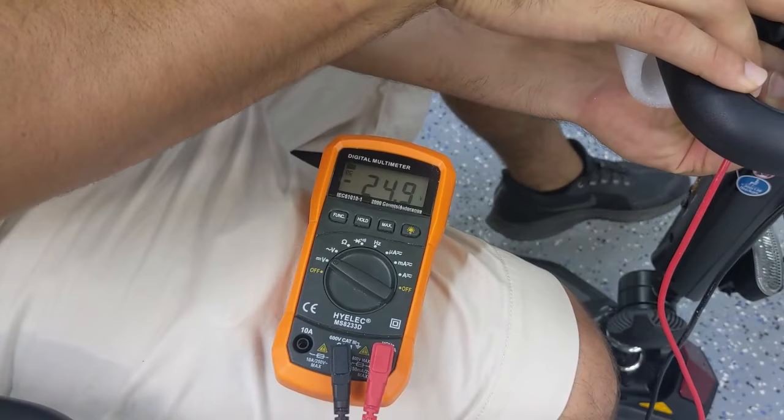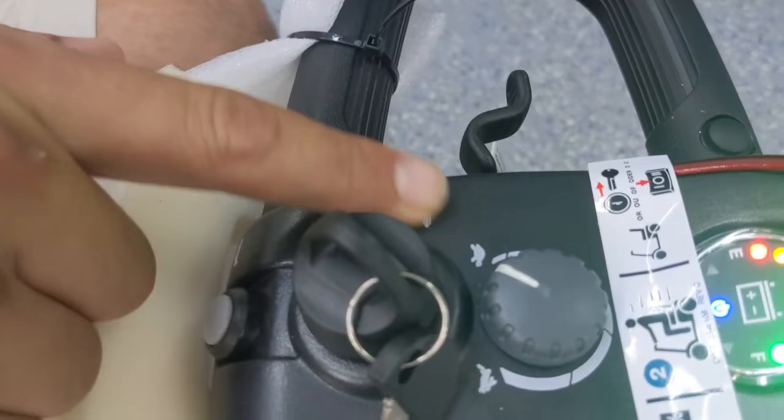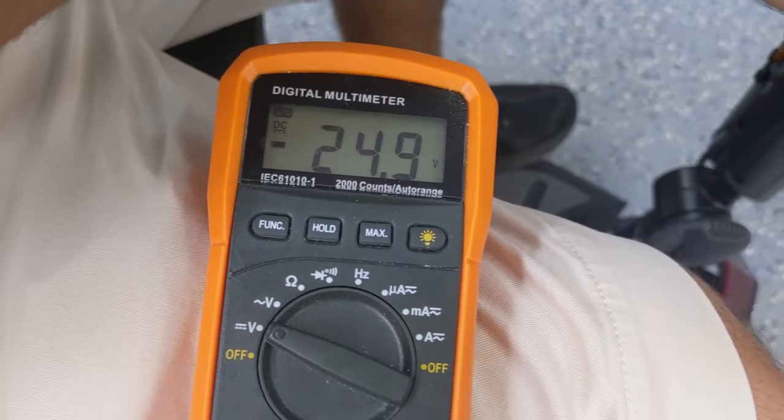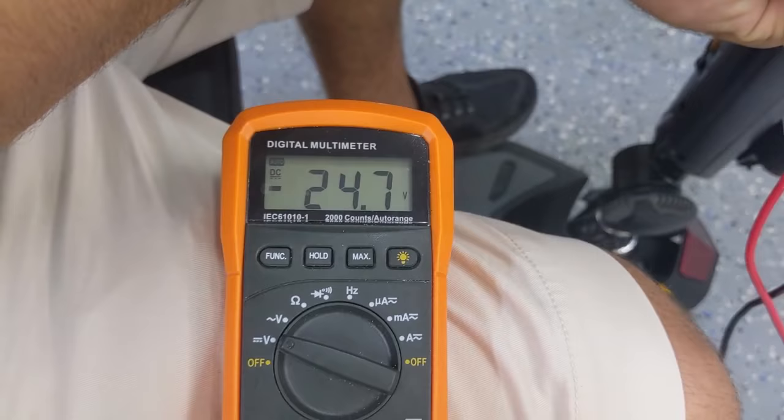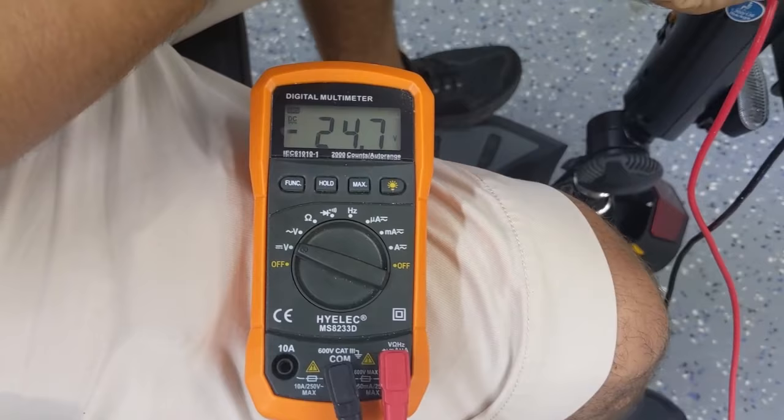Once we have a steady reading of 24.9 volts, I'm going to put the speed all the way down to the slowest setting and keep an eye on the voltage meter to see what happens when I start moving. As you can see, now that I'm moving, the voltage is not going much lower than the full charge voltage — and that's what you want to see. Reversing, you'll see the same thing: the voltage is staying steady above 23. Anything above 22 to 23 volts is good.